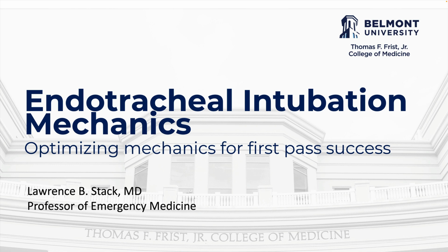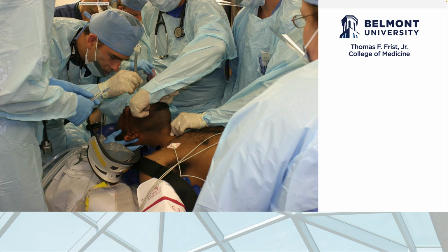Endotracheal intubation is a life-saving but dangerous procedure. Whenever possible, optimize your environment and mechanics for first-pass intubation success. You've decided to intubate your patient. Let's presume there's no trauma and the patient is spontaneously breathing.